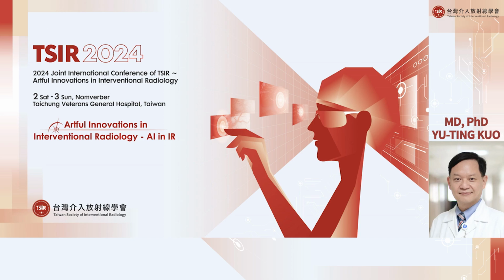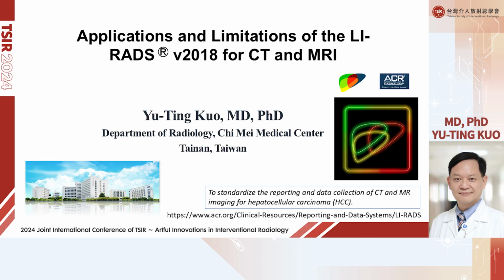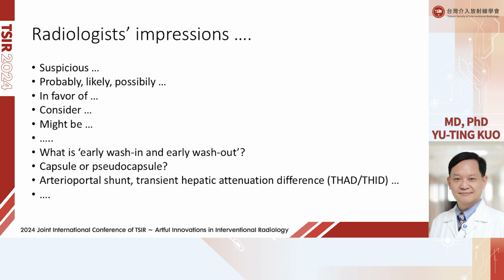Good morning, everyone. Today I'm going to be talking about the application and limitation of LI-RADS, particularly version 2018 for CT and MRI. Why should we have LI-RADS? Because a radiologist's impression is usually variable from one radiologist to another.